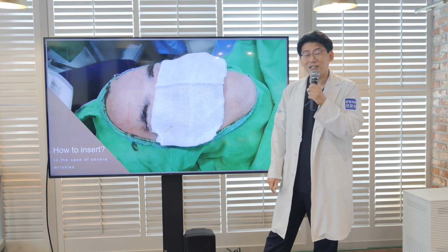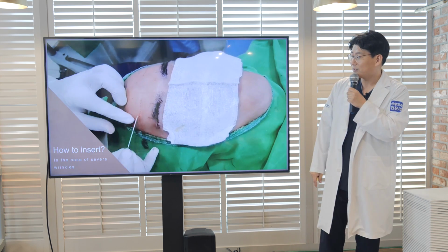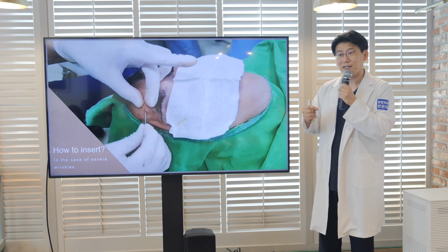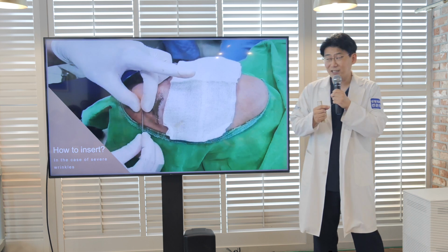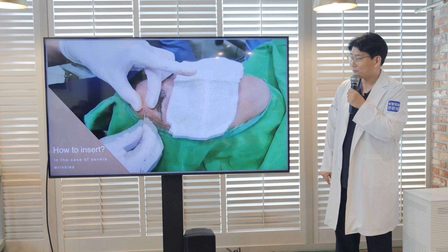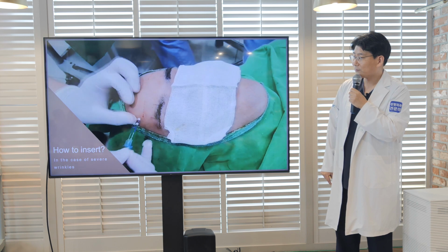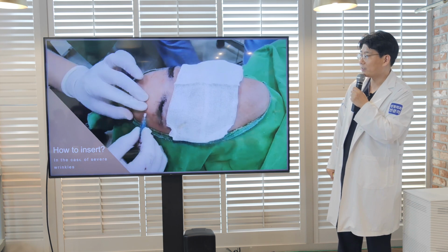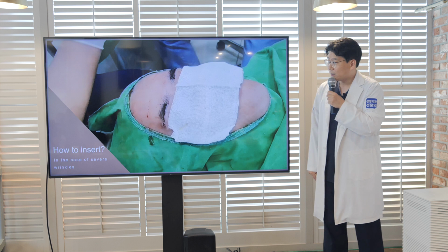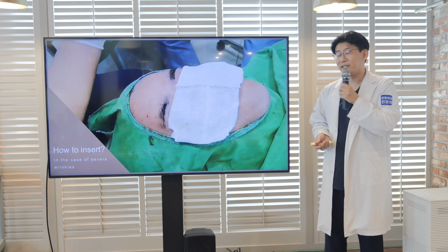I applied multi-line thread on forehead wrinkles. Make a puncture with an 18 gauge needle. I apply subcision with an 18 gauge cannula to make space for the multi-line thread. I insert the multi-line thread. Very simple. The maximum volume will be established in a month. It takes time for collagen synthesis.